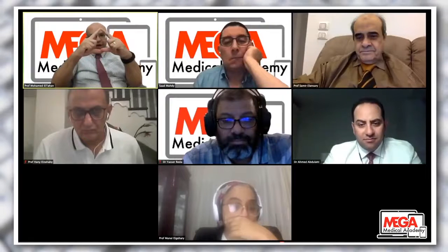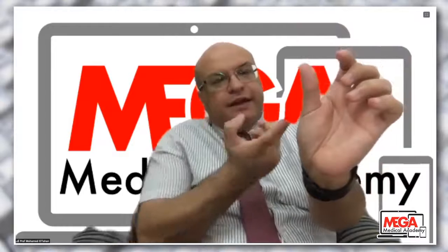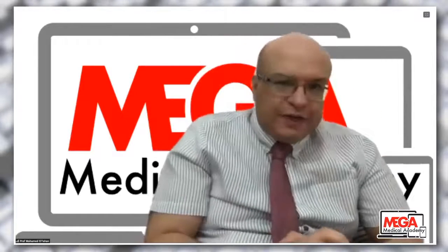Yes, that's what I explained during the talk. This is one of the major problems. You can insert the tip of the scope until the glottis to reach the best glottic view, but in such case, you cannot advance your tube in its natural curve. You need to sacrifice with this. You have to get the tip of your laryngoscope, either channeled or traditional blade, as far away from the glottis, just to see part of the glottis in a good view, but not an optimum view. Then insert your tube, with the natural curve, with a hockey stick stylet, reshaped stylet. It will advance the tube into the glottis.